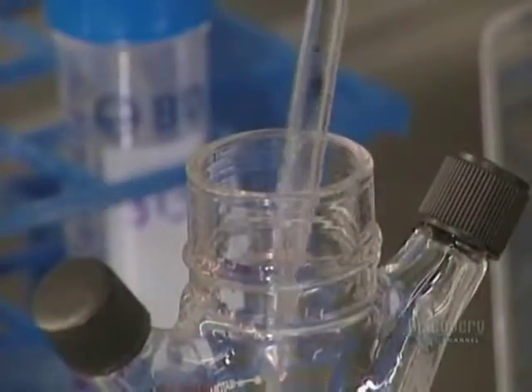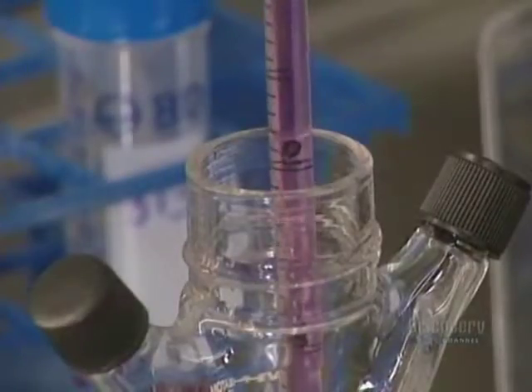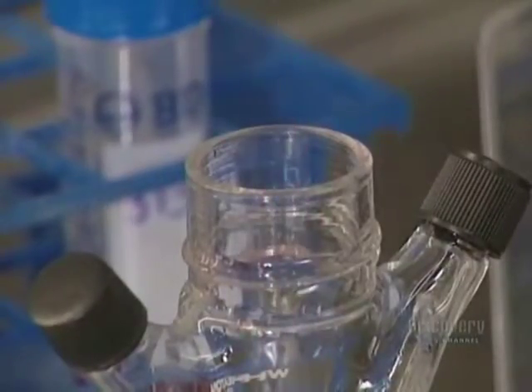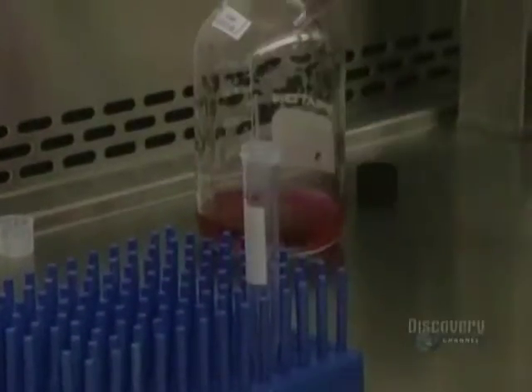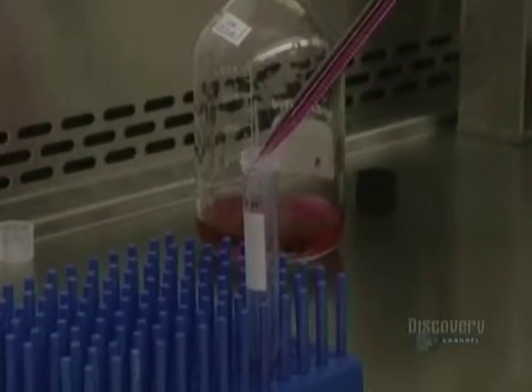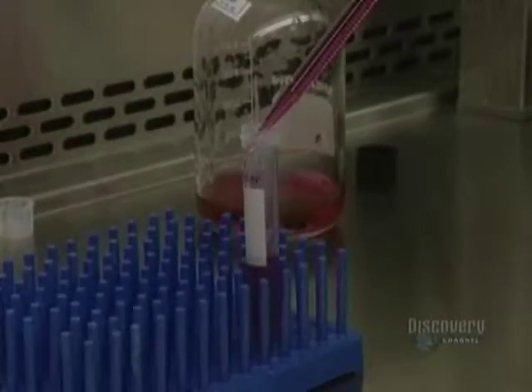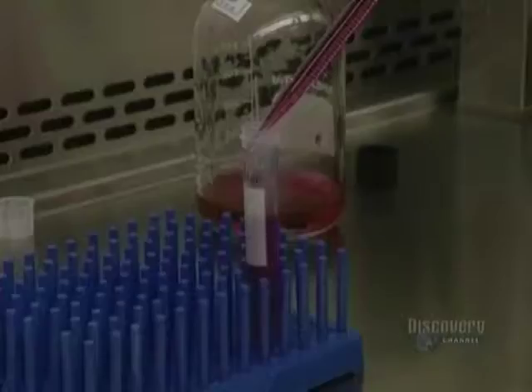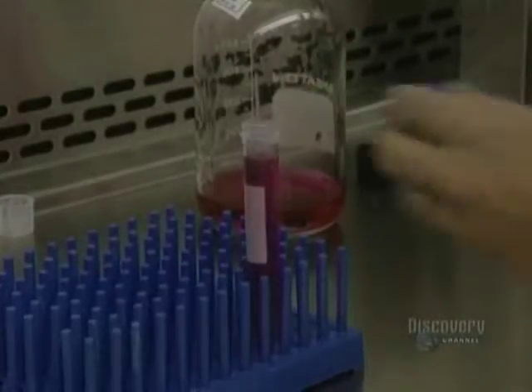The cells do not have to remain in extended contact with the trypsin. They are inhibited with a medium containing serum. Then the liquid containing the cells in suspension is drawn off. The liquid is centrifuged to obtain two fractions. The base fraction containing the desired cells is at the bottom of the tube, while the upper floating fraction containing the trypsin has to be removed. This upper fraction is drawn off with a vacuum system.